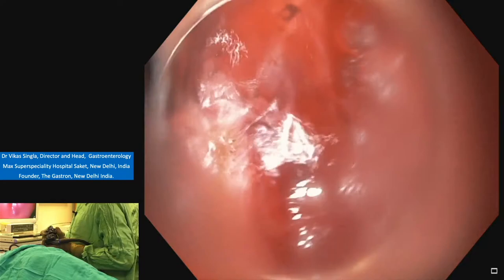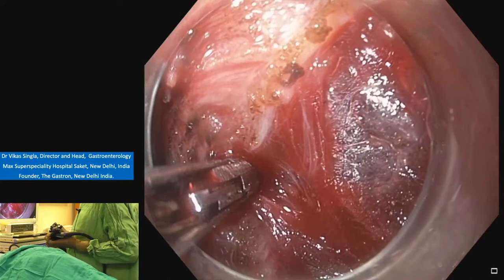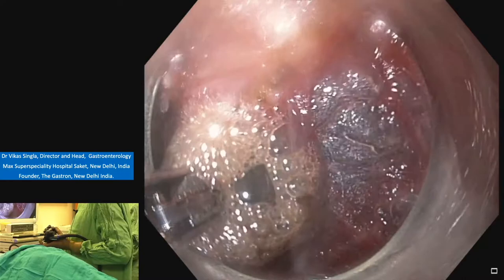Now you can see the spurt there. Open, grab it tight. Now we can coagulate the vessel. It's very essential to locate the vessel, and now you can see some bubbling effect. So don't panic. Even if there is a bleed, don't panic.